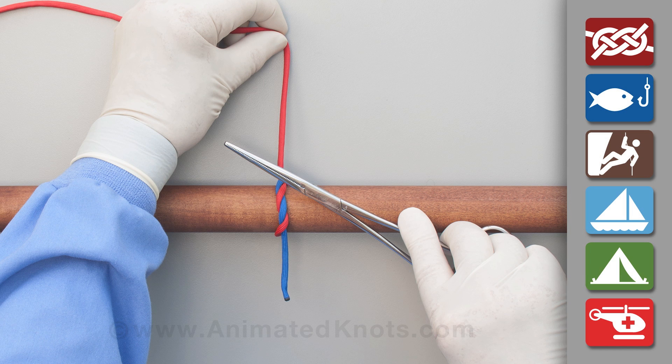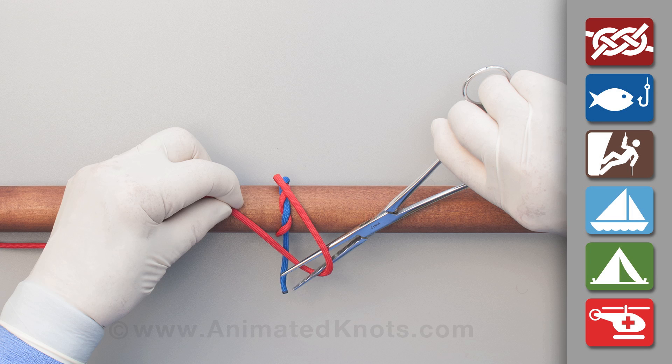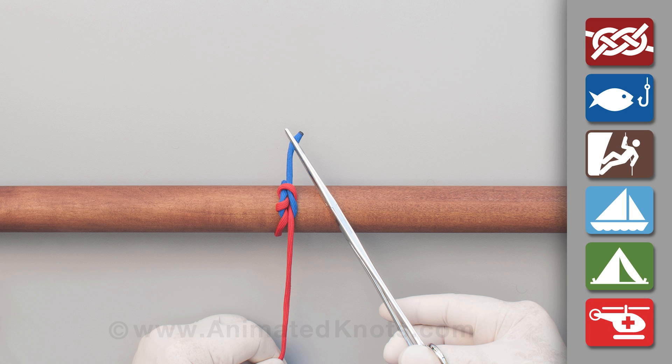Now pull the long end across the forceps, again use the forceps to reach for and pick up the short end. Pull tight to complete the ligature knot.